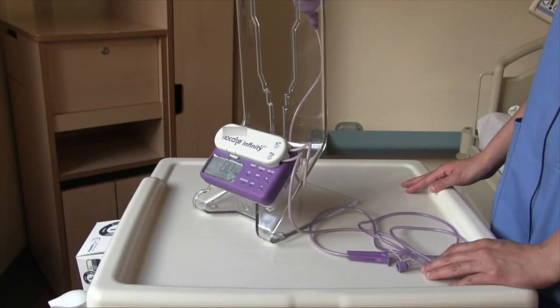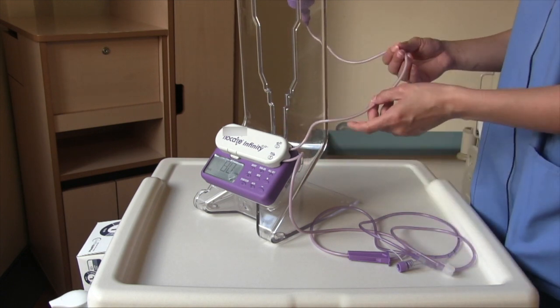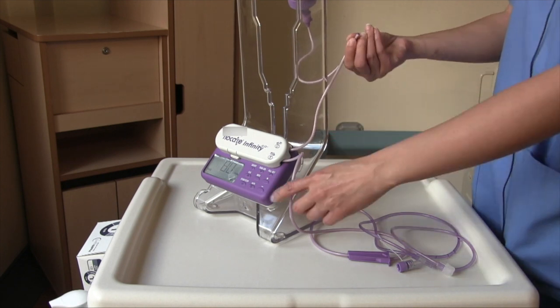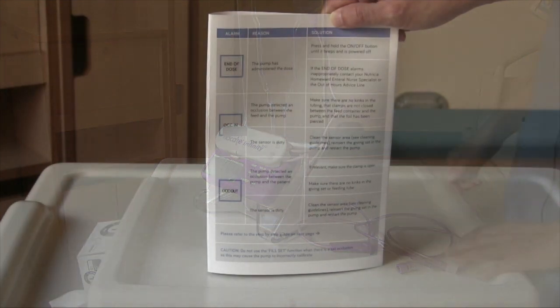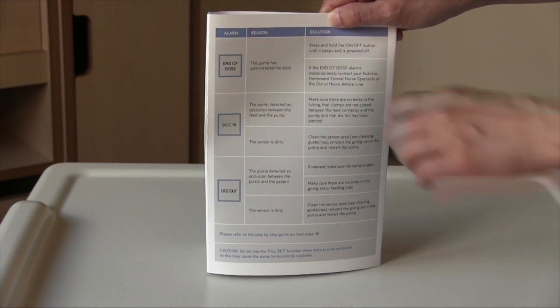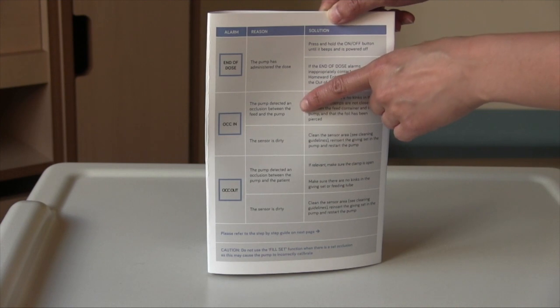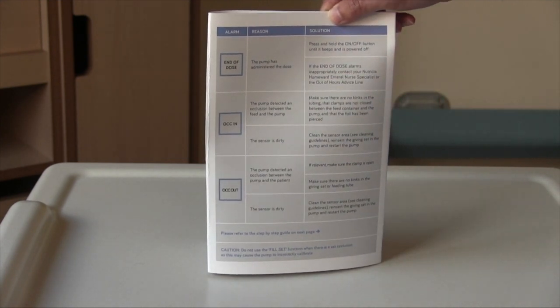We will now go over some of the issues you may encounter. Your tube coming into the pump may get kinked, as well as the tube coming out of the pump. So if the tube coming into the pump is being kinked, on the screen it will show OCC in, which means occlusion into the pump. And it will give you an example of why that may be happening and how to resolve it.